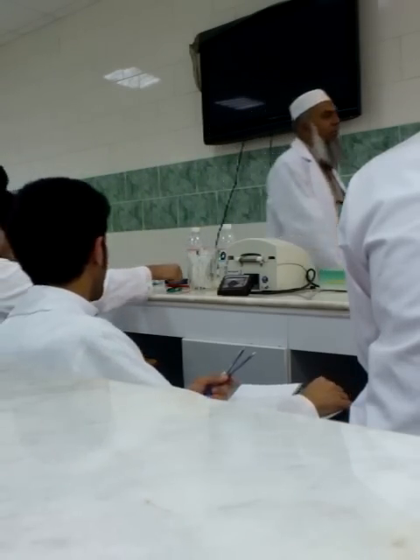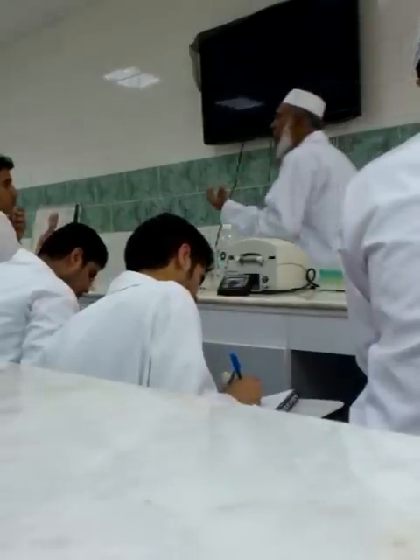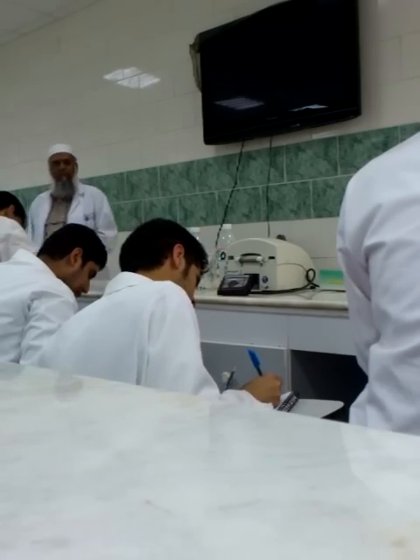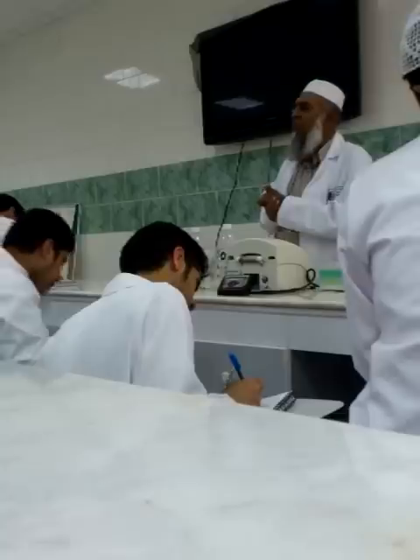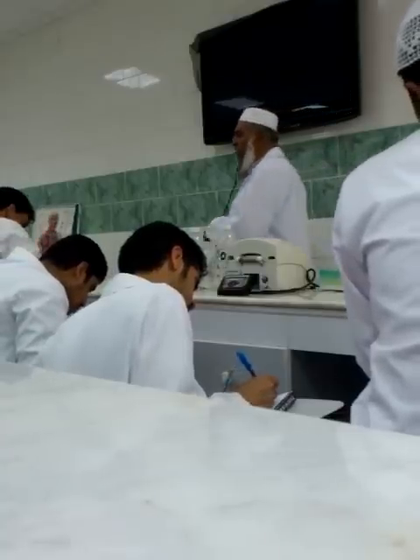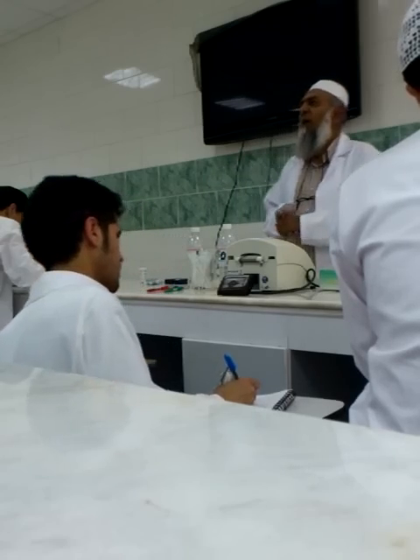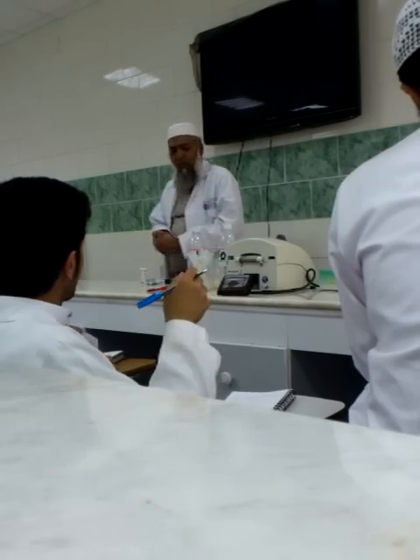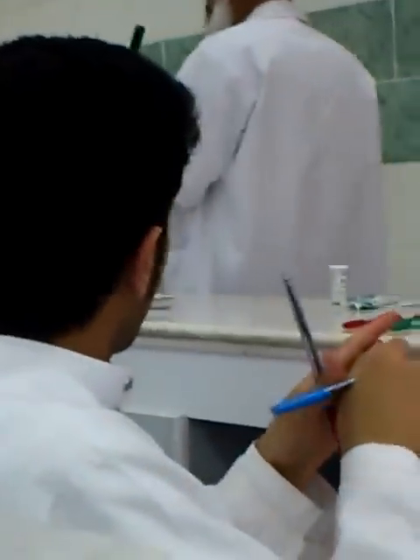Coming to the point of how we will measure this glucose level before and after exercise. There are various methods to measure the glucose level. Like before, we measure glucose by using a spectrophotometer. But one very simple method is to measure glucose by using a glucometer.